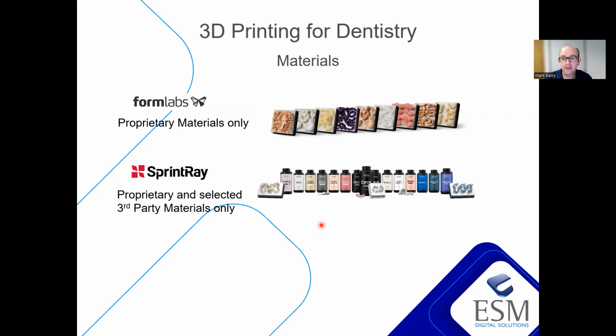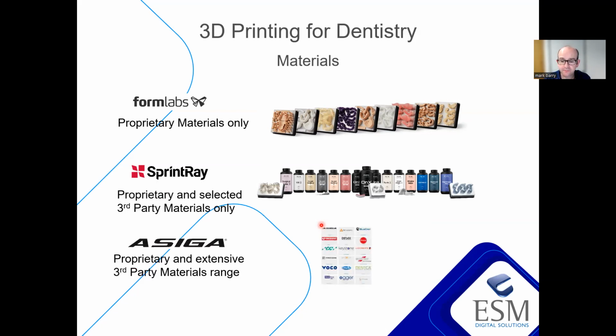SprintRay have their own range of materials as well, and obviously there's an emphasis on using those materials in their printers. However, they have a validated workflow for a lot of third-party materials, meaning you can take selected third-party materials, put them into your SprintRay system and be very confident that you're going to get the right result at the end of that process.